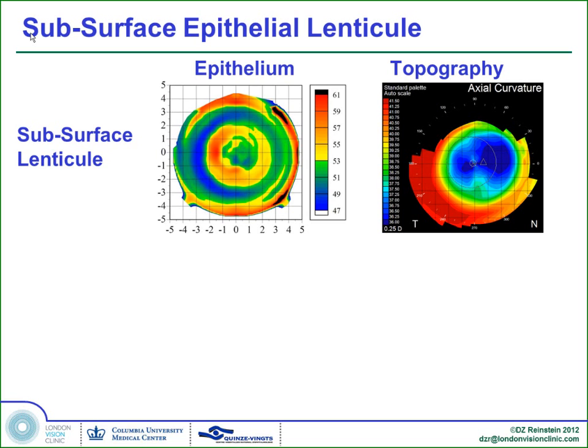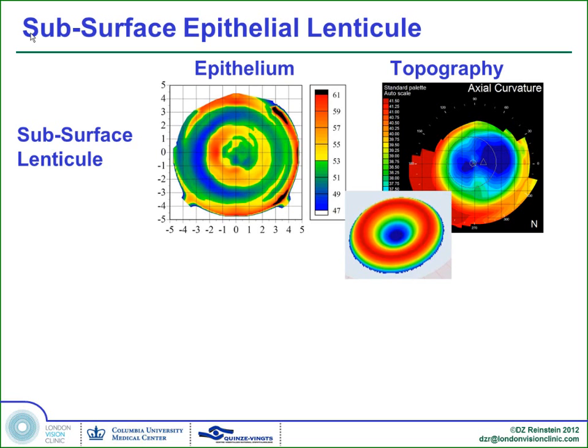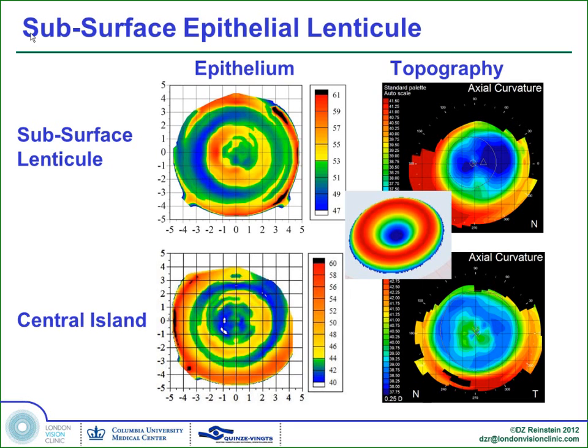And so it's a subsurface lenticule, which is different from what many, for example, WaveLight users have experienced, where you push the slider too far and you get a central island because you've carved too deep and the epithelium can't compensate fully.